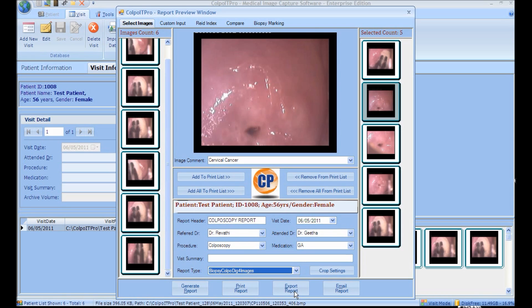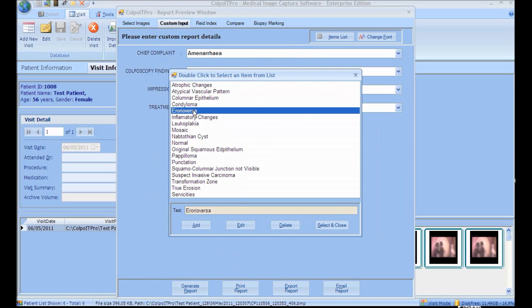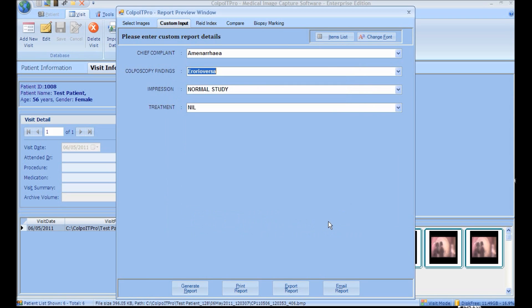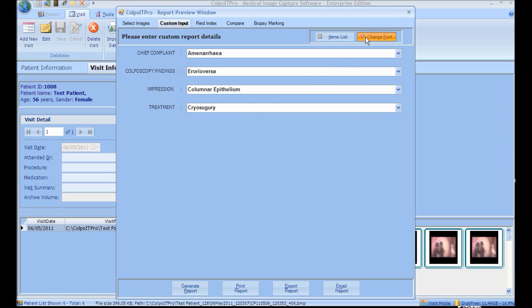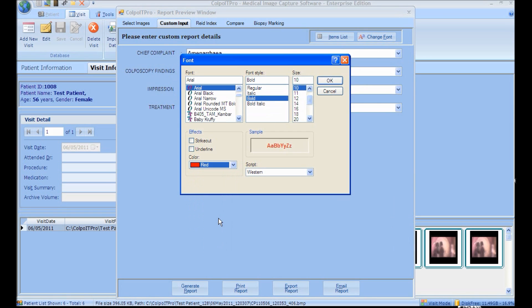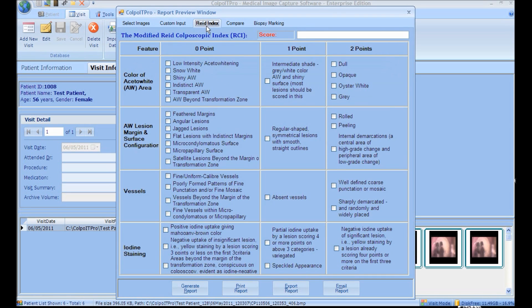Report types can be selected. To add report details, click Custom Input. The data can be entered from a combo box or by selecting from the item list. New data can be added or modified in the item list. Font can also be changed by clicking the Change Font icon. The report details are customizable.